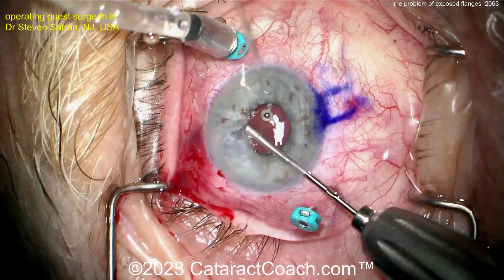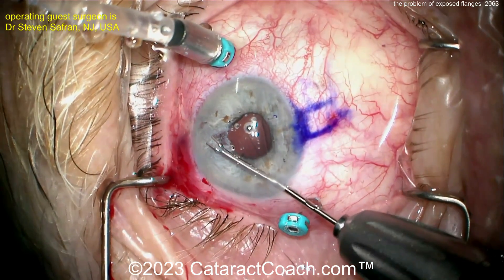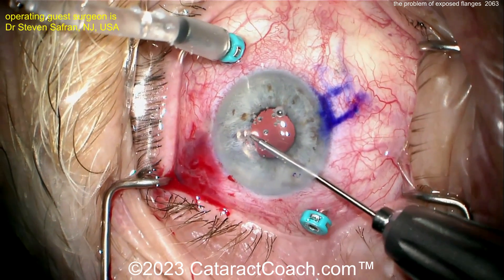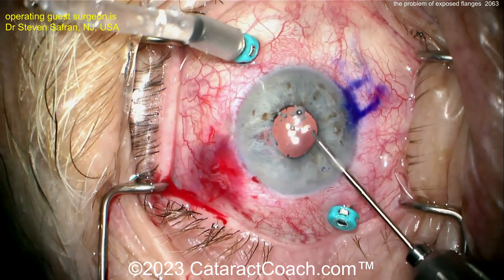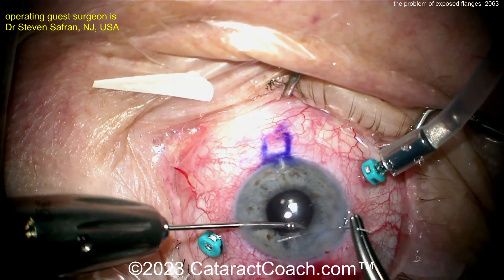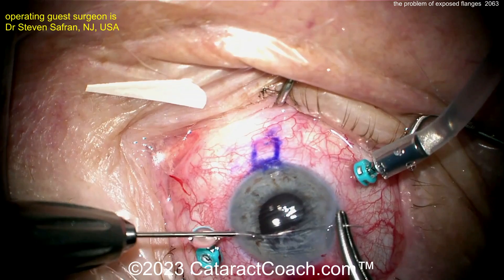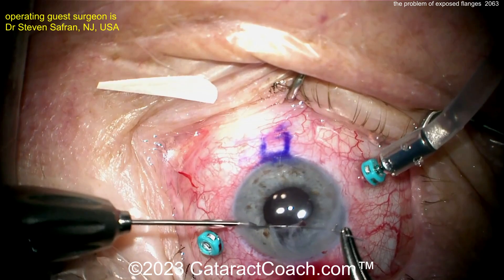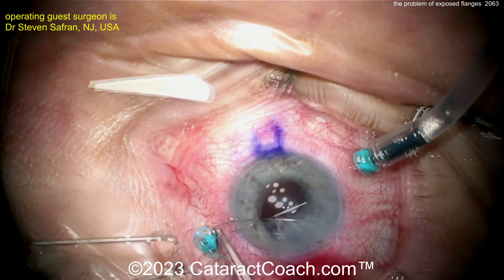This is a great case. Tomorrow's podcast is with Steve Safran. Dr. Safran explains some of the pitfalls of doing just a straightforward belt loop procedure, or even doing a Yamane and having those flanges become exposed. He'll give you some great pearls in the podcast tomorrow, which will help you do a better job for your patients.